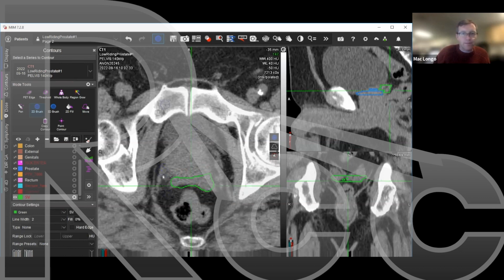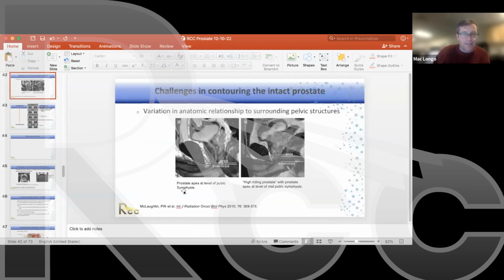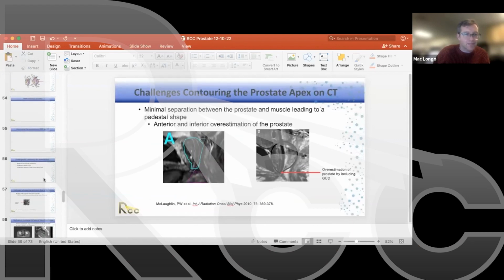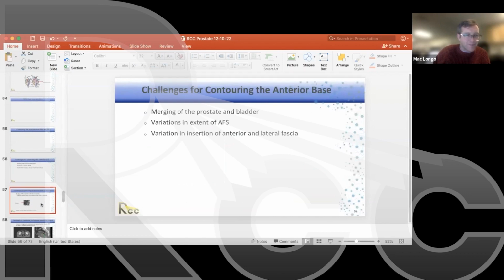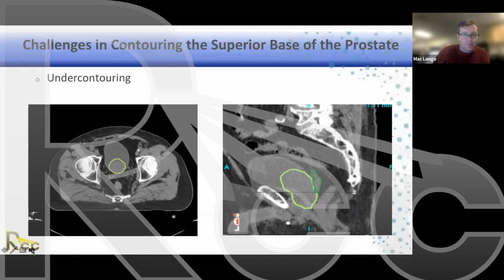Let me just go back to my PowerPoint slides to wrap things up about the seminal vesicles here. And again, you will have access to all of these slides, so you can go through them. It's my first attempt really trying to live contour, so it's a new experience for me.